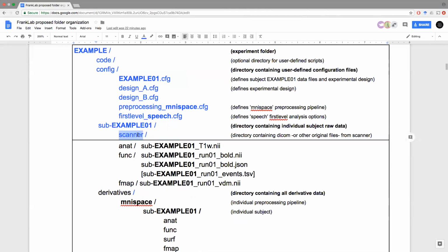What do you think? Well, so we know, barring some change, which I think Matthias suggested may be the case, but barring some change in how FreeSurfer's data organization structure works, we need to have them. You need to have all of the subject directories of the FreeSurfer processing output in a single top directory. Yep.